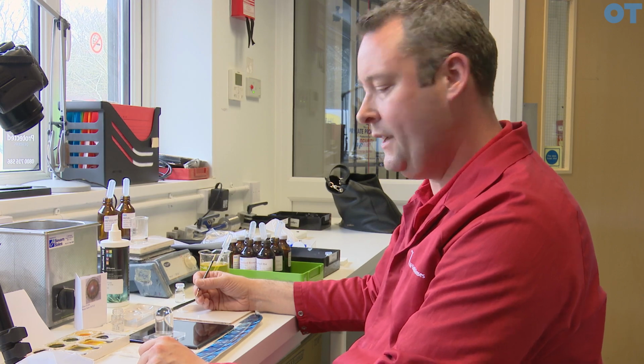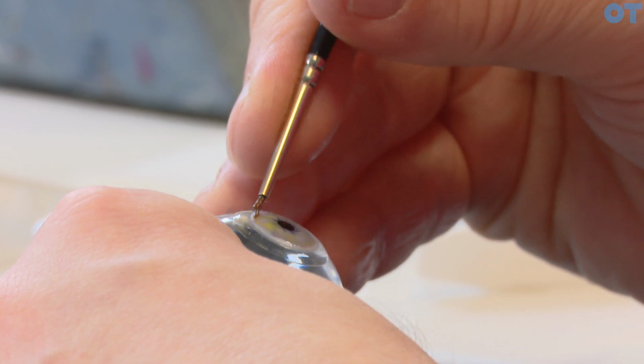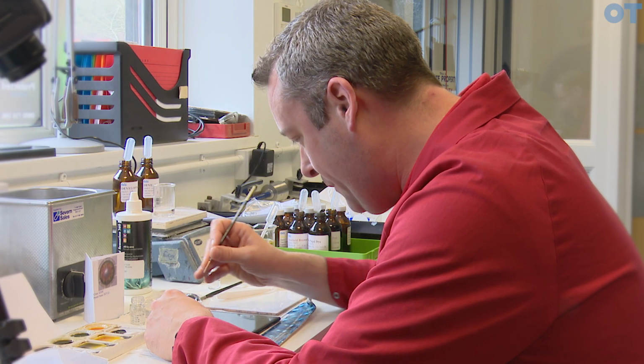Mostly you're just thinking, how's it going to look when they wear the lens? Is it going to work? Is it going to match their other eye? Is the effect going to look natural enough? And obviously you don't want to go too dark or paint the lens too light. Either way it doesn't look correct, and then obviously the patient won't be happy.